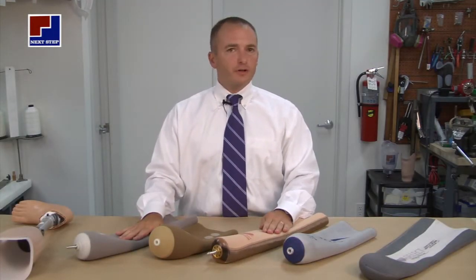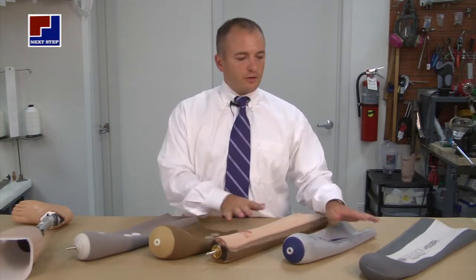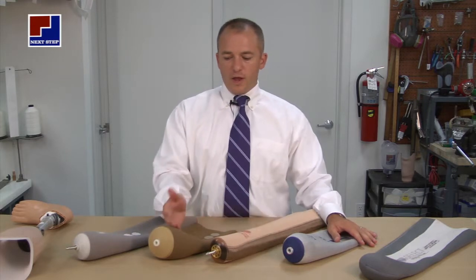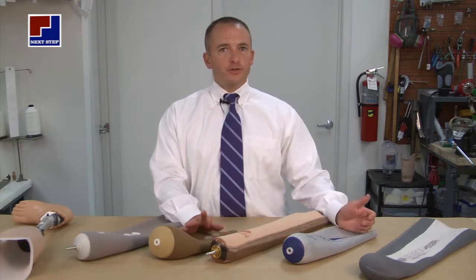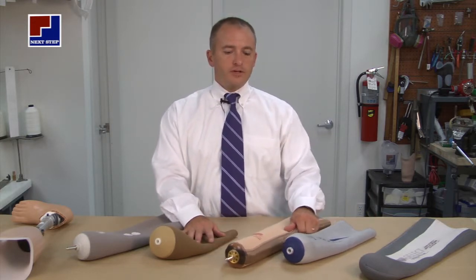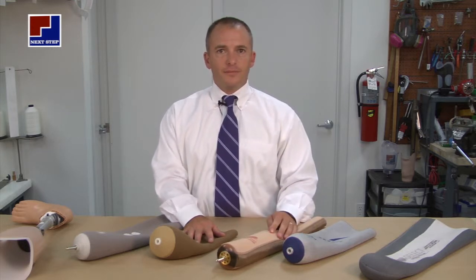Depending on the patient's characteristics, their skin condition, and their activity levels will help determine which prosthesis will be used. If you have any questions or concerns, please contact us or you may find more information on our website. Thank you.